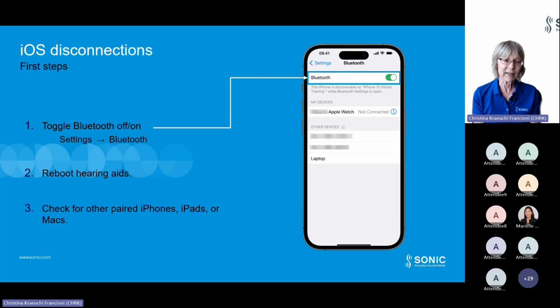So it means if the hearing aid user would like to use it with the iPhone, then he should switch off the connections on the iPad or other devices and then only use the connection on the iPhone to bring the streaming back. There is one difference where you should not switch off Bluetooth, and this is if you are having issues or if you are having also your hearing aids connected to the Mac.